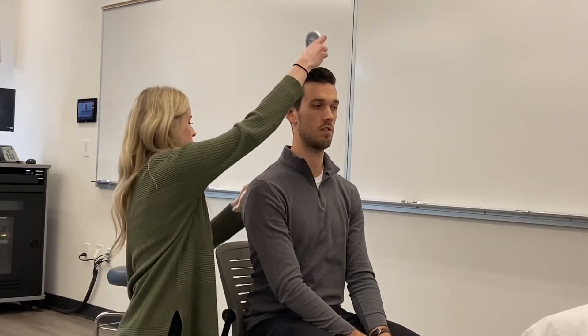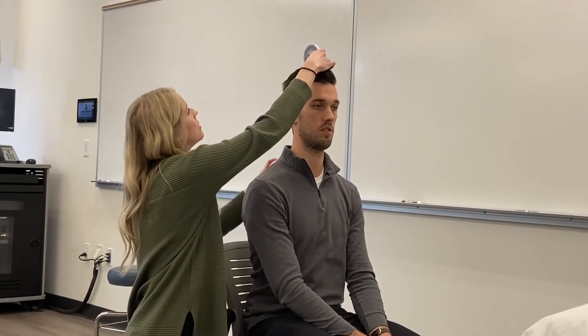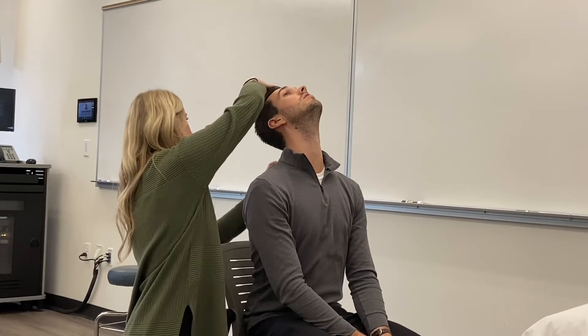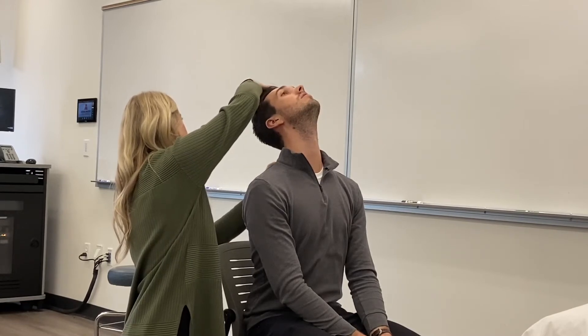For extension, we're moving the thoracic inclinometer to the spine of the scapula — that's T3. The reason why we're moving a little bit lower is because when they go into extension, if we kept it on T1, his head is going to hit it, especially if he's getting 80 degrees. So again, you're going to put one on top, zero it out, put one on T3, zero that out. He gets 80 degrees on his head and his thoracic spine didn't move at all, so 80 degrees total. You would subtract if he did move at his thoracic spine.